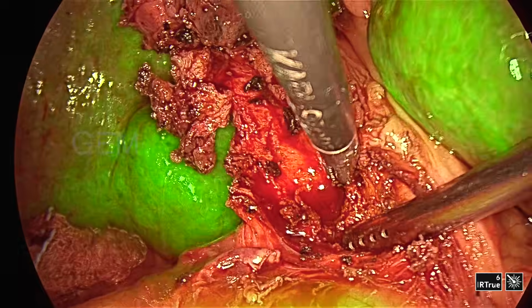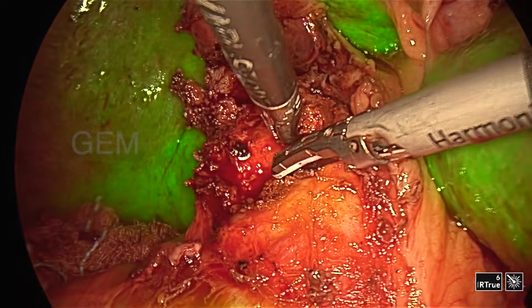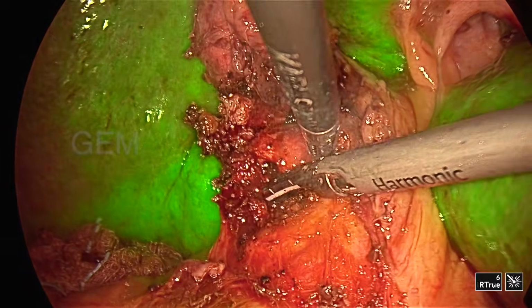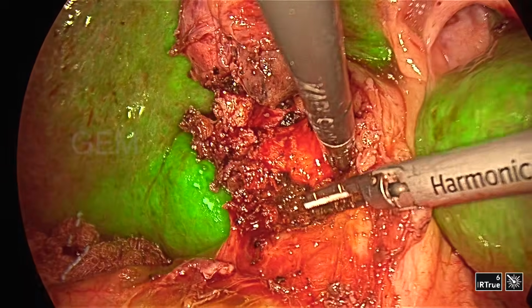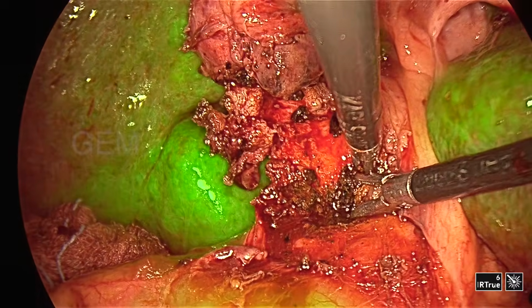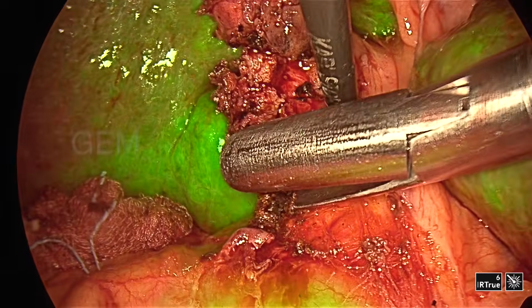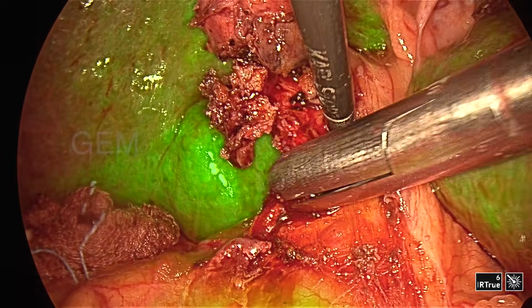I cannot open medially because the CBD is there. So with this opening only, I am trying to remove the stone. So slightly I am opening the inner wall. You can see here. Now it will give a little bit better access to the stone. So I am removing the stone bit by bit with the 10 mm stone holding forceps.